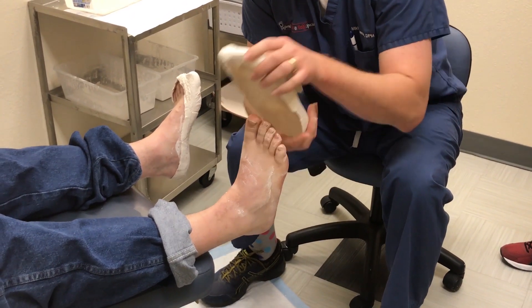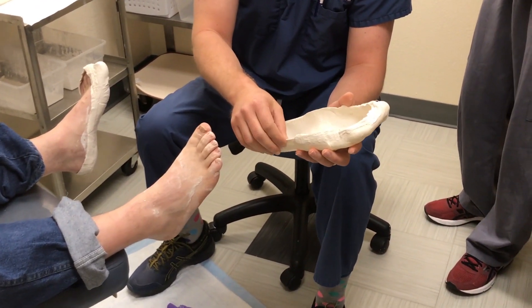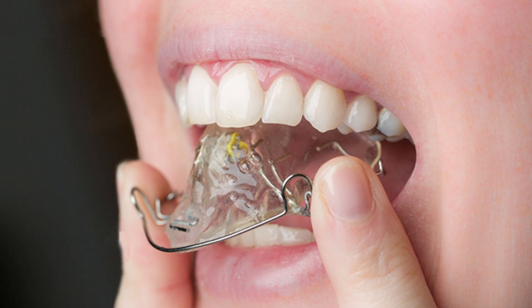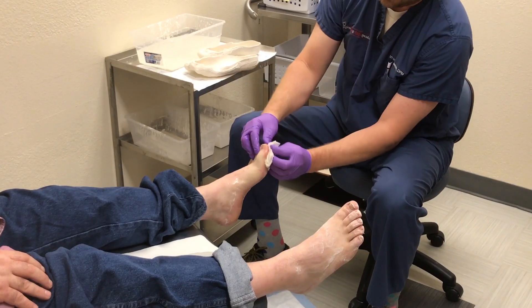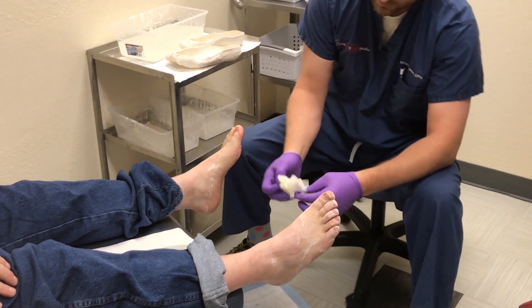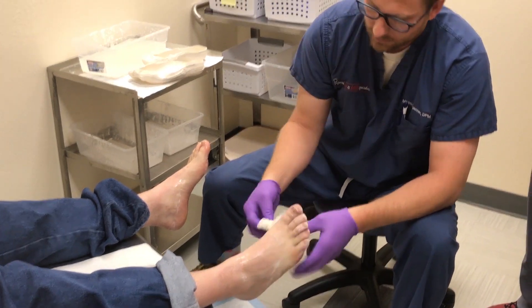To help illustrate that, consider the way an orthodontist dispenses a retainer to someone who has their braces removed. They take a mold of the mouth because they want the retainer to put pressure equally on every tooth so it doesn't move. If you've ever stopped wearing your retainer and tried to put it back in, you know exactly what I'm talking about — your teeth start to move and the retainer doesn't fit. Similarly, when an accurate mold is made of the foot, the pressure applied by the orthotic is applied equally.